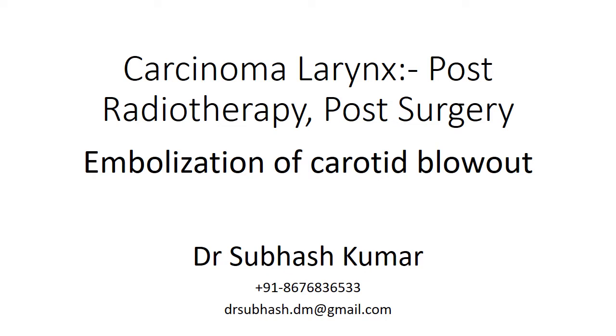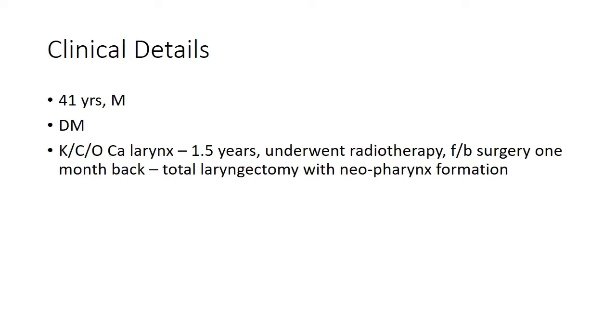Today's case is that of an emergency embolization for a lingual artery pseudoaneurysm in an operated carcinoma larynx patient. Patient is a 41 years old diabetic male, diagnosed with carcinoma of the larynx since 1.5 years. He underwent radiotherapy first, followed by surgery about a month back, in which total laryngectomy with neopharynx formation was performed.